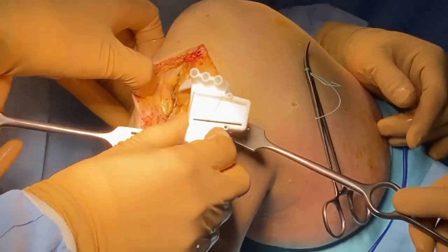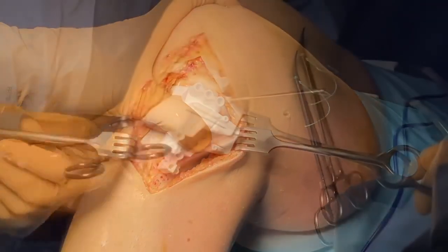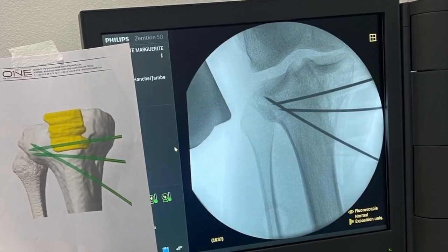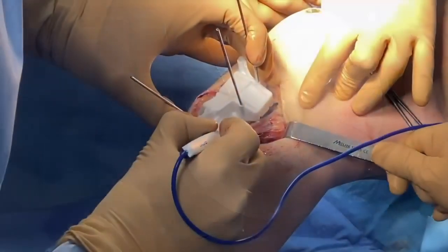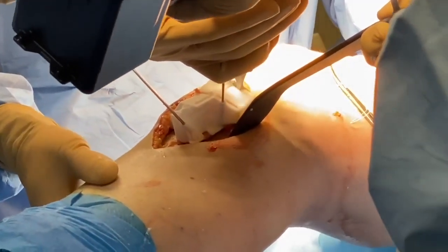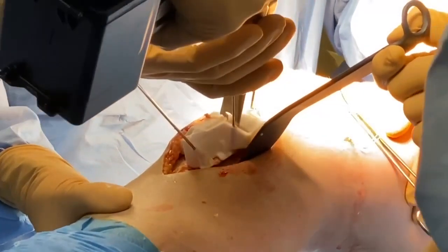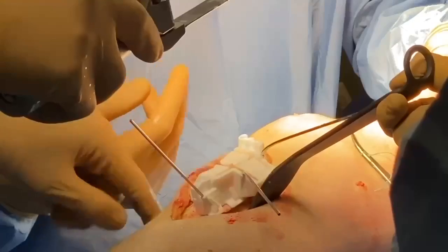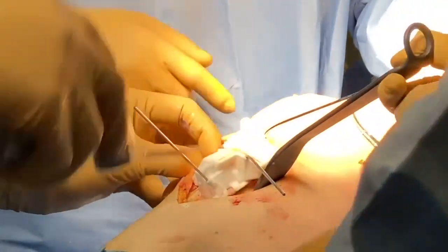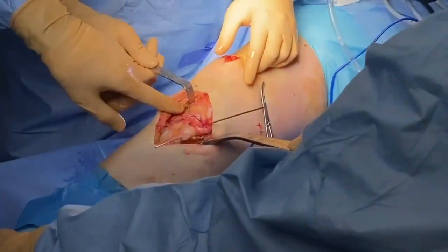We then use a patient-specific cutting guide that would help us to create those different windows, the anterior one and the medial one. We verify the position of the key wires that's supposed to be exactly the same as the one on the planning. Once the PSI is secured into the patient bones, we do the different cuts. There are 6 different cuts to be performed inside of the cutting guide to create the complete 2 triangles, the medial one and the anterior one.